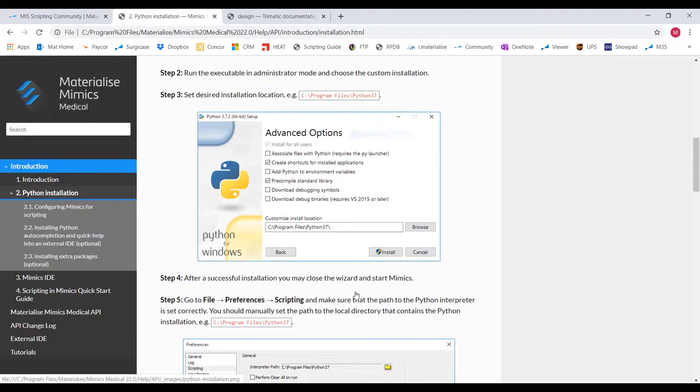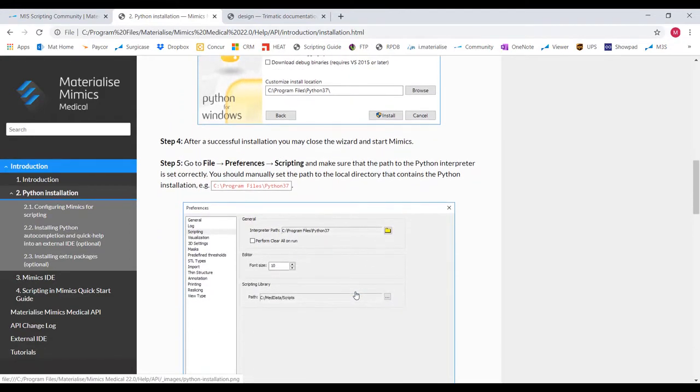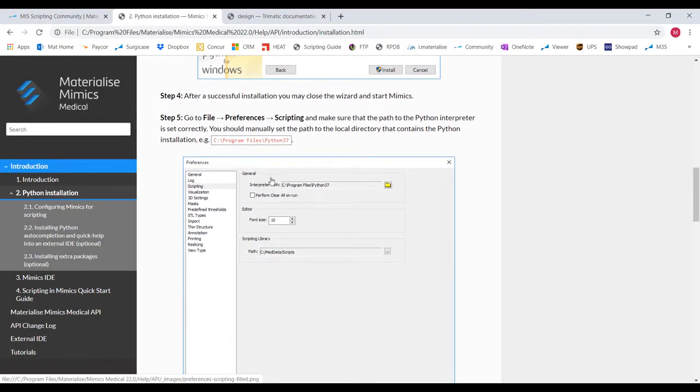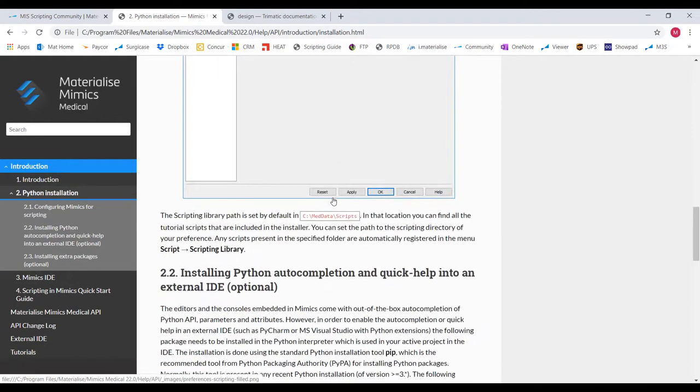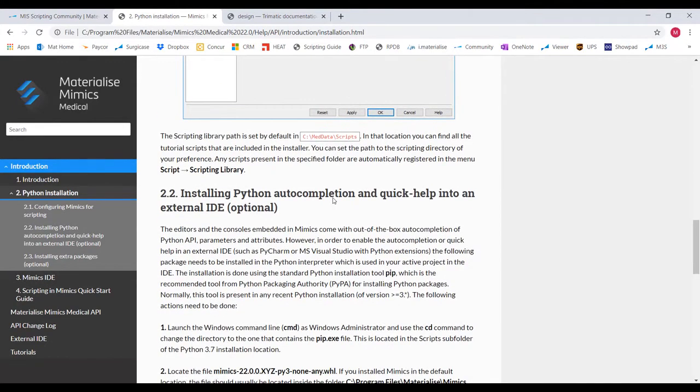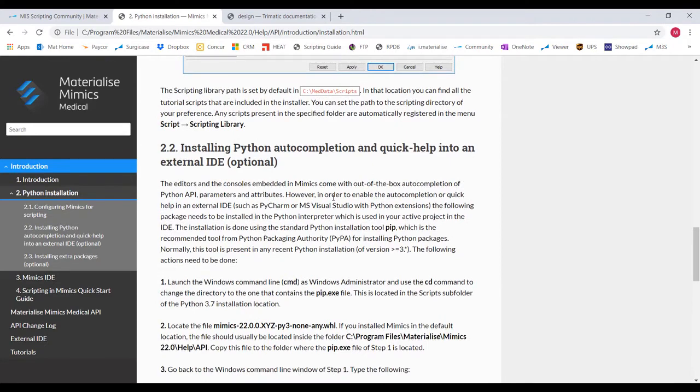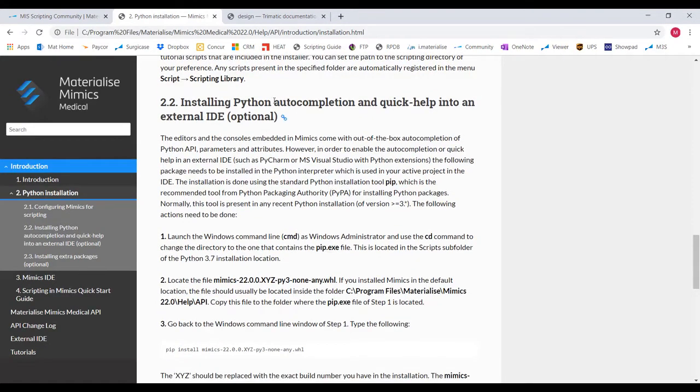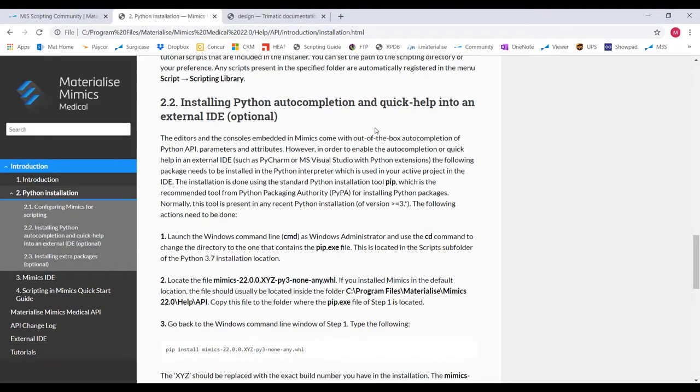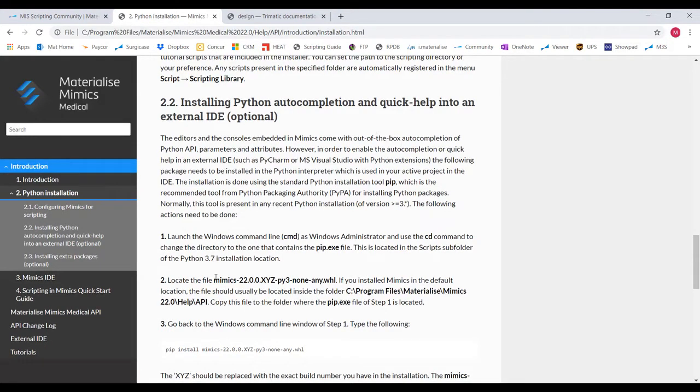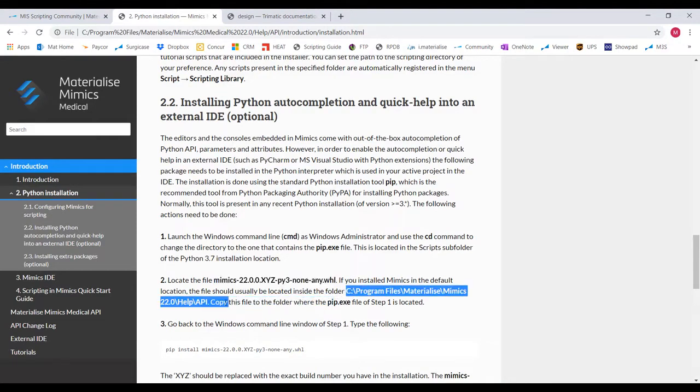Once you're done with the installation, make sure to tie that folder location to both Mimics and 3Matic under their Preferences Scripting section so it can locate the Python program. Finally, we're going to want to install some packages and other helpful items that we'll later use while scripting. The first one being this auto-completion capability where if you do choose to type your scripts out rather than copy-pasting from the existing scripts, this will help to autofill the rest of that line of code you're typing.